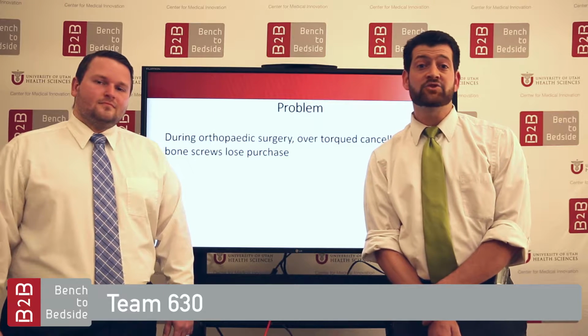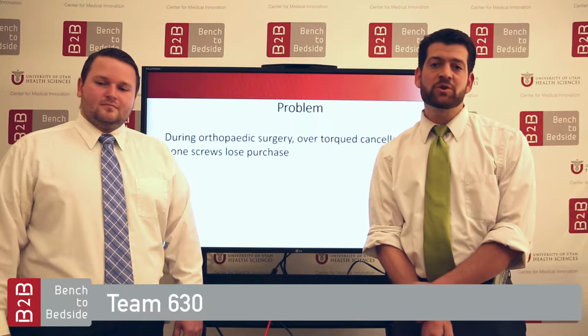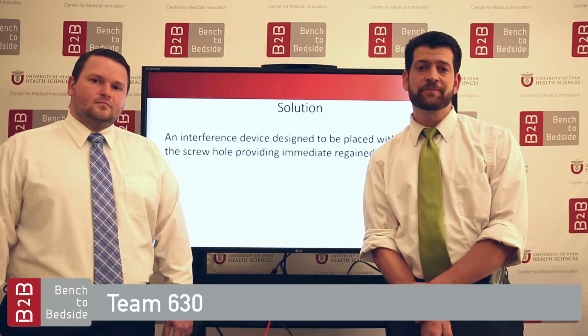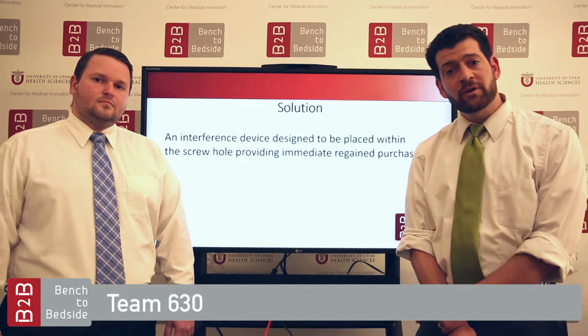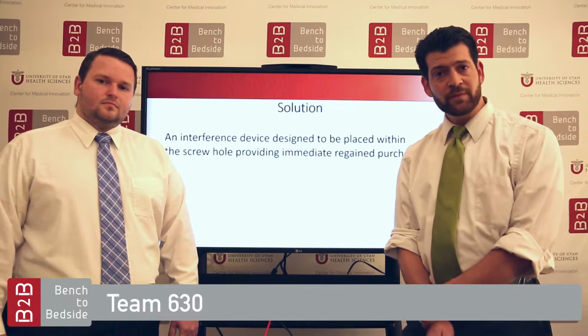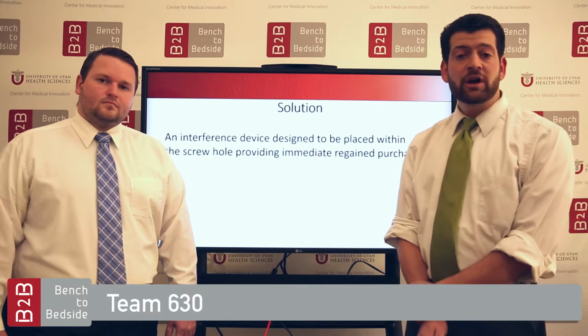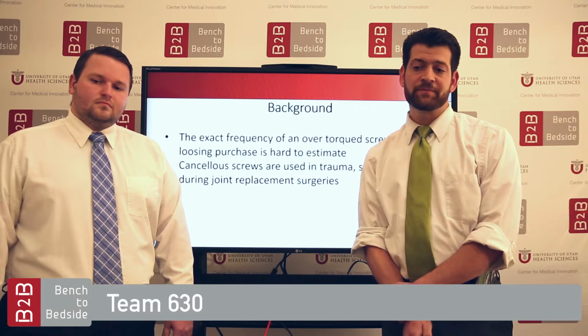The problem we'd like to address today is during orthopedic surgery, a cancellous bone screw may be over-torqued and lose bone purchase. The solution we have in mind would be to remove the stripped screw, place an interference device into the hole, and replace the screw, immediately regaining screw purchase.